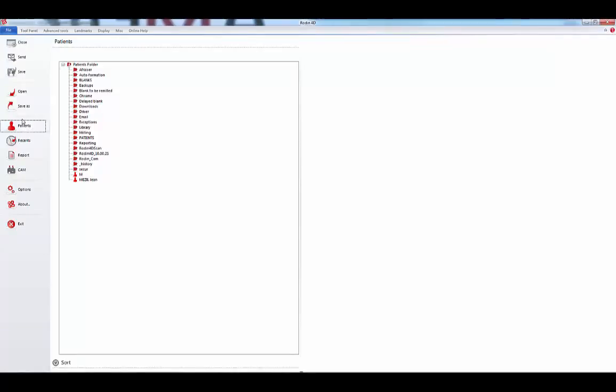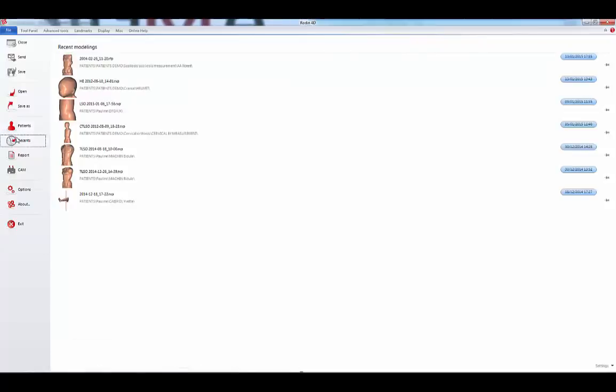In Rodin 4D Neo, you can also see the list of the recent forms you worked on.